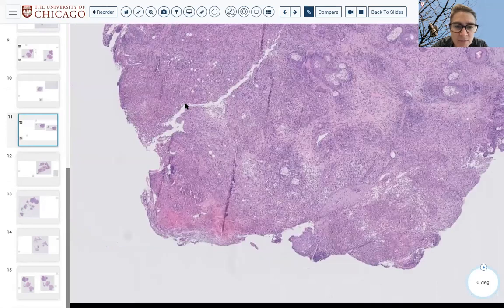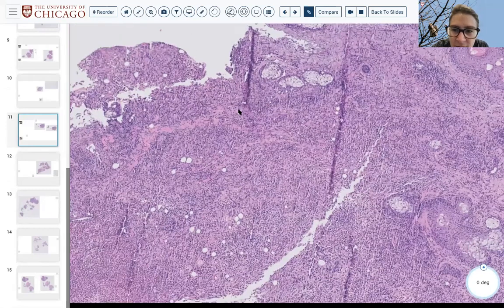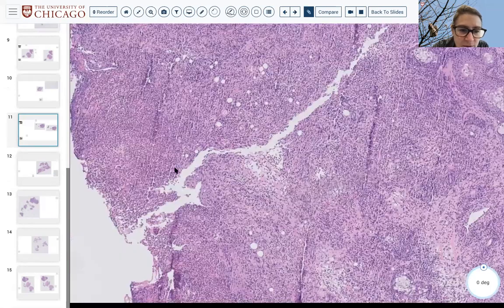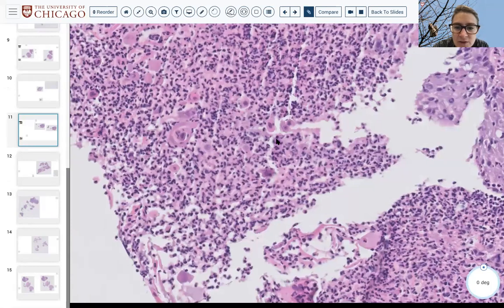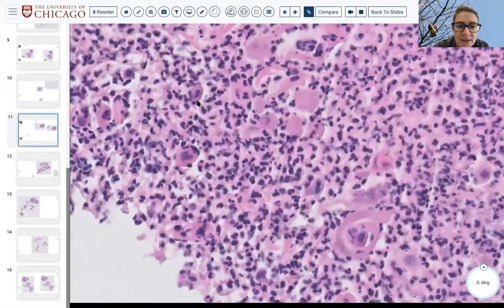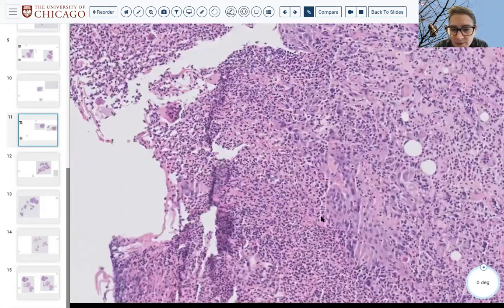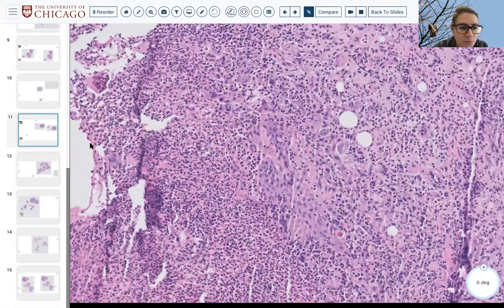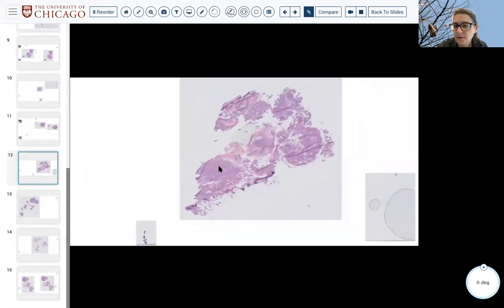So this is the permanent remnant of that tissue that you can look over on your own, but it is super hard to interpret because of all of this inflammation. But if you look carefully, in the inflammation, what are all these dyskeratotic, single, hyperchromatic cells doing? Those are cancer cells. Okay. Oh, there's another, maybe an island there. Okay, if you want, I can do the last two pretty quickly, or you can tell me what you saw, whatever.